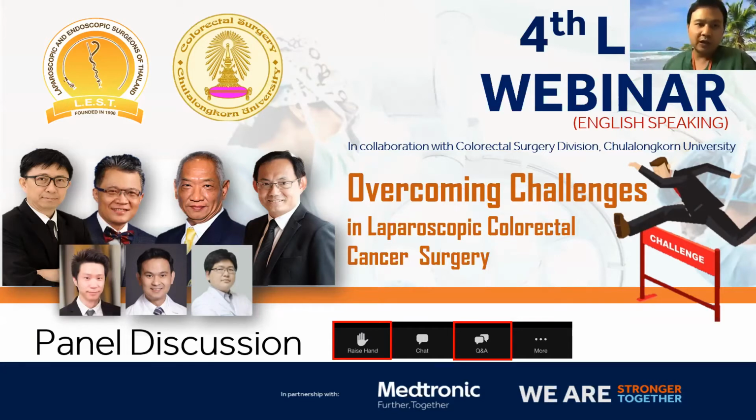After radiation or other kind of neoadjuvant treatment, we re-evaluate, and usually we do en bloc resection, like multi-visceral organ resection anyway. And now we also do laparoscopic surgery for T4 lesions in rectal cancer. We do a lot of laparoscopic exenterations, every week, for the laparoscopic exenterations or even sacrectomy. We can do them by minimally invasive surgery too.